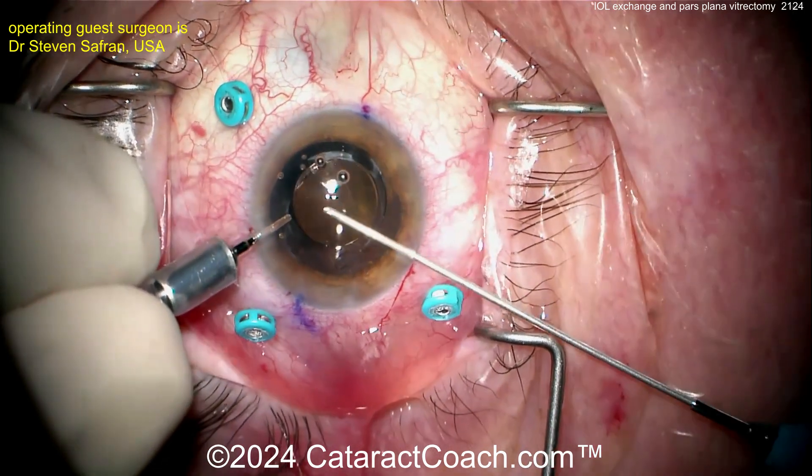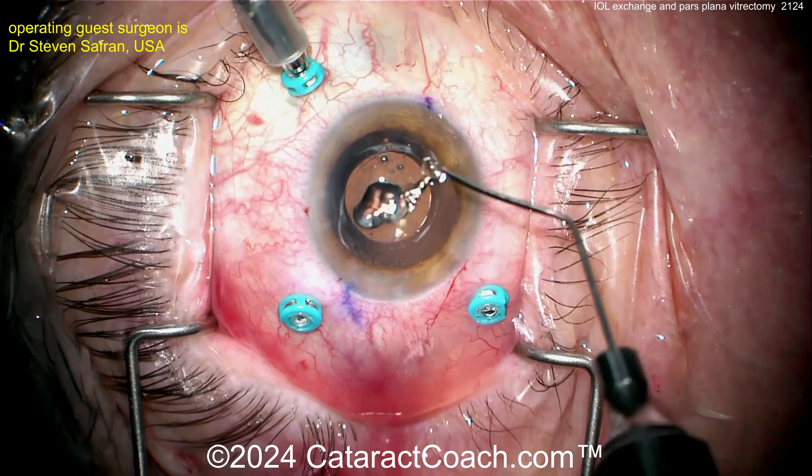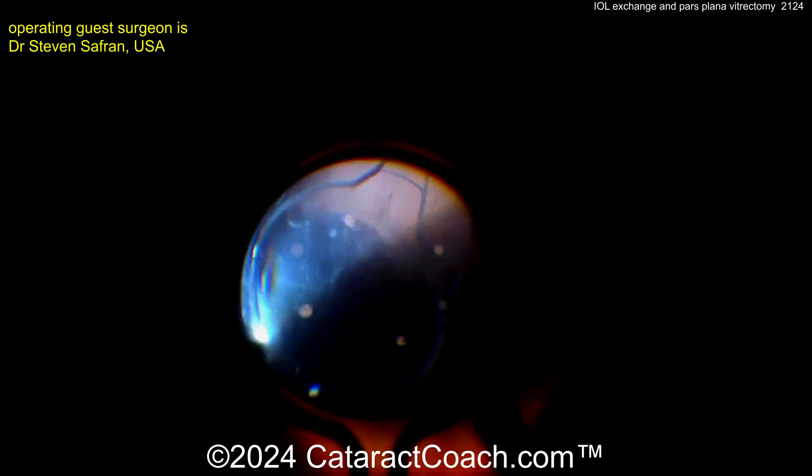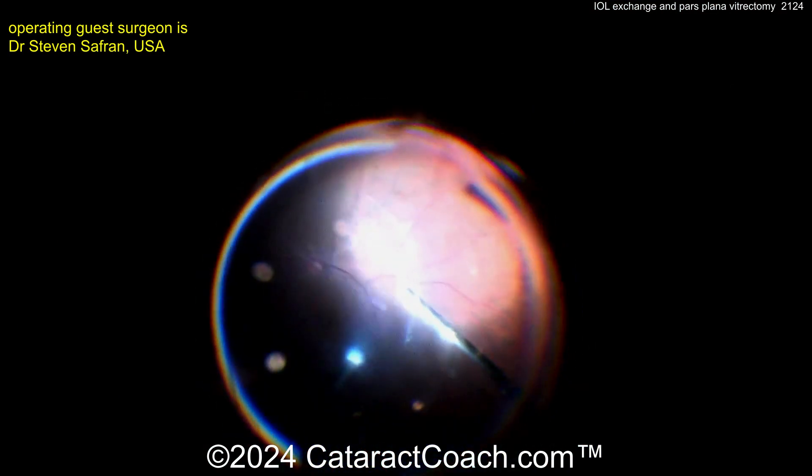Getting the viscoelastic removed. Now there is a posterior segment viewing system. There's the toric — you can see the toric marks line up pretty well. Now look back there — he's going to make sure he's got a good PVD and do a complete vitrectomy.